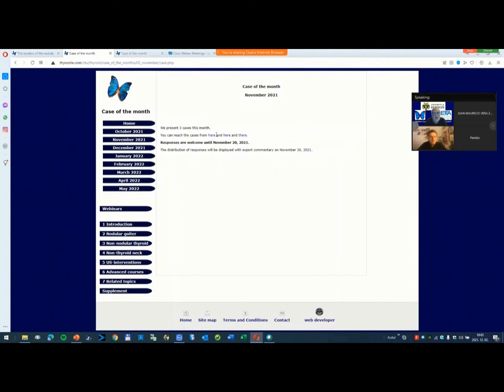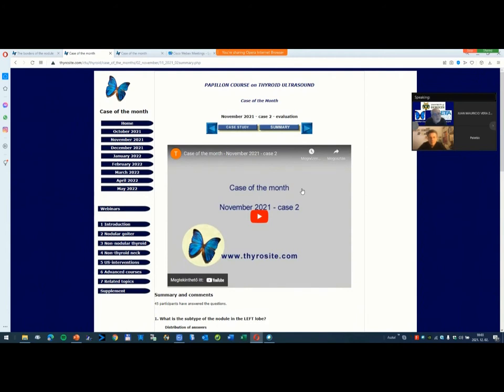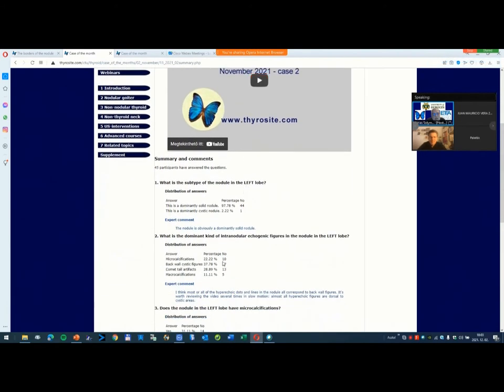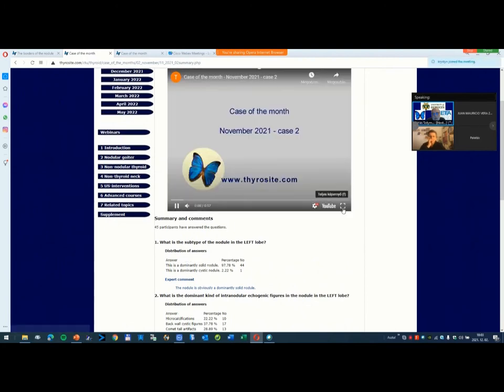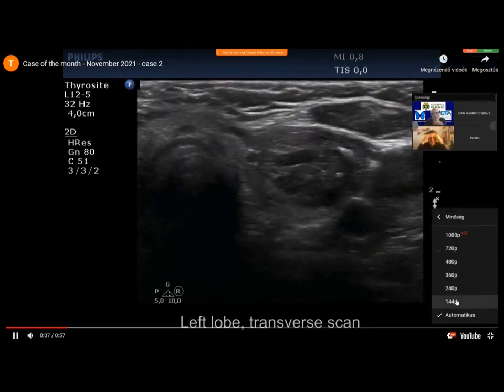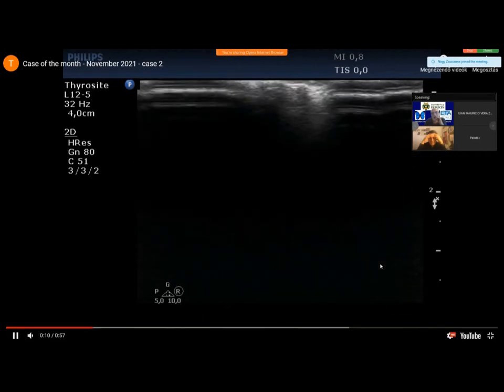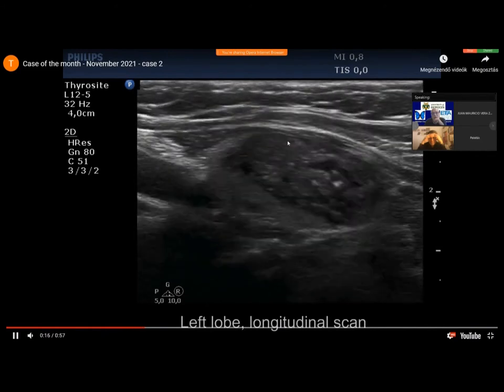Here we are in November. I will make some comments about the second case. As you can see, there was a high disagreement about the second question about the dominant intranodular echogenic figure in the left lobe nodule. I will show first the video. This nodule was in question.